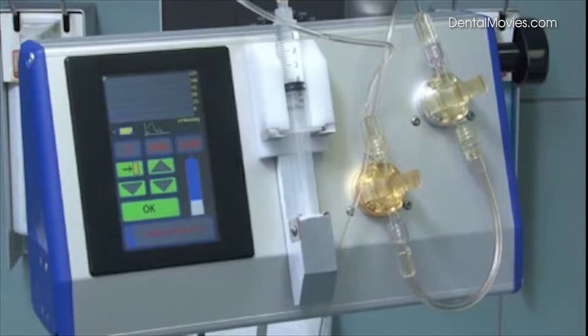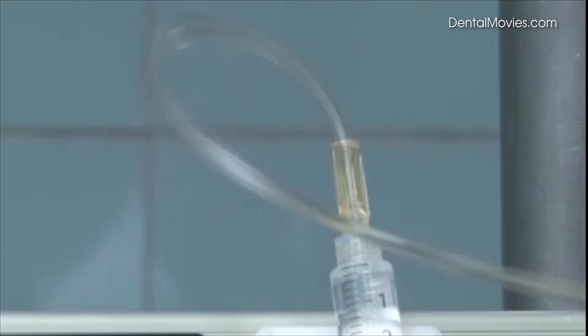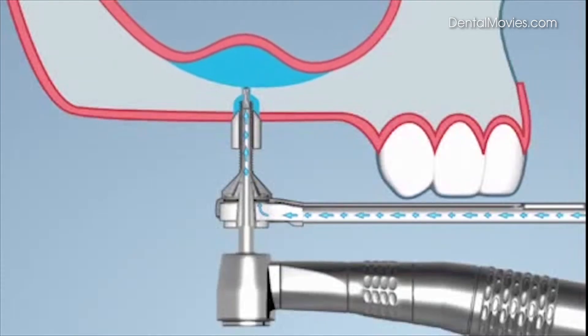Additional liquid is injected using the pedal switch. The liquid vibrates in order to facilitate the detachment of the membrane from the bone. The vibrations in the liquid detach the membrane from the base of the maxillary sinus in order to generate space for the augmentation material.